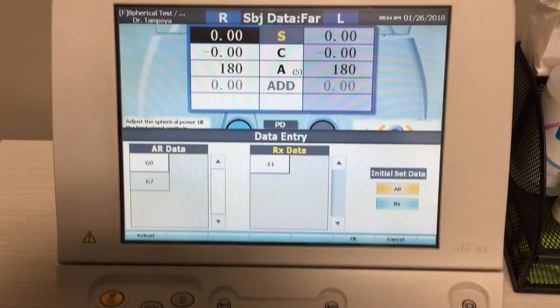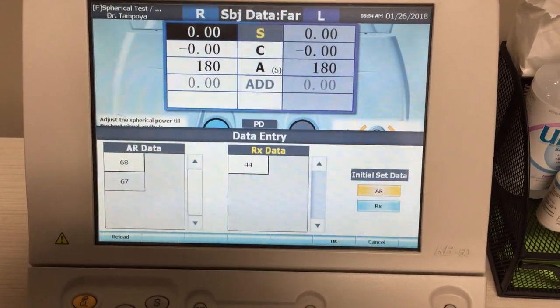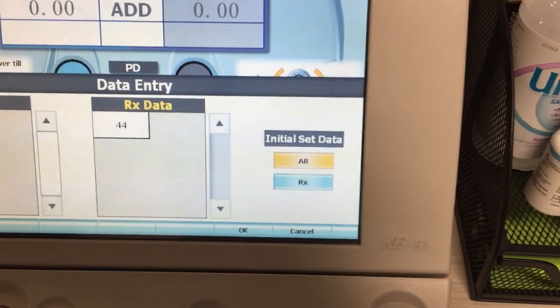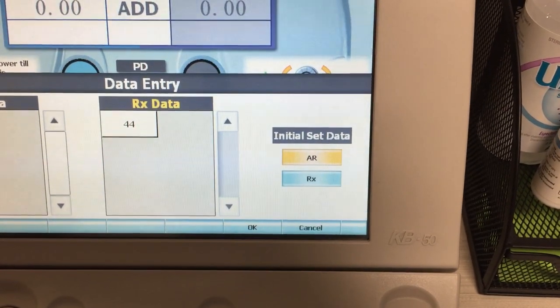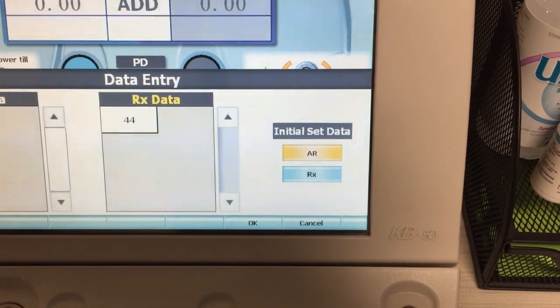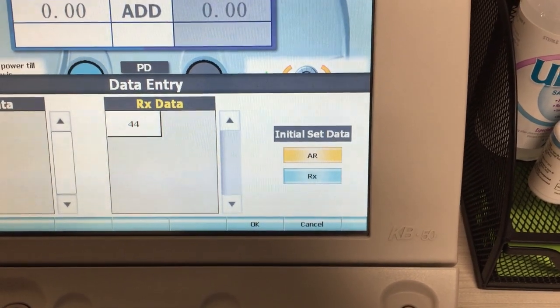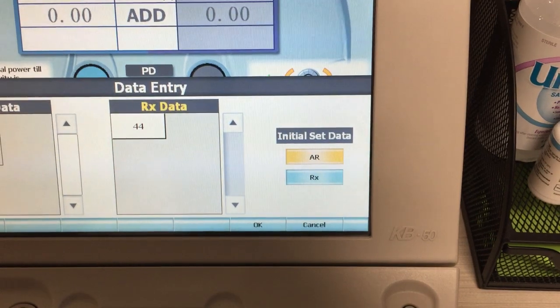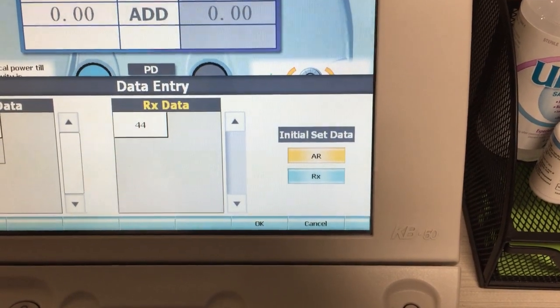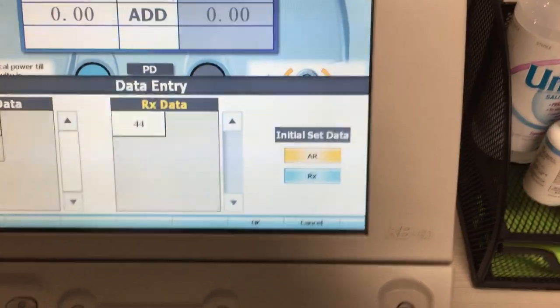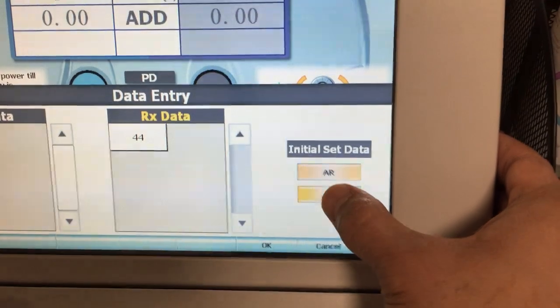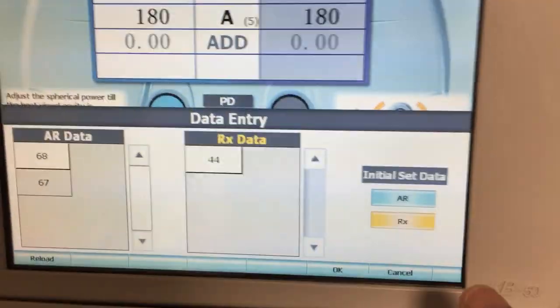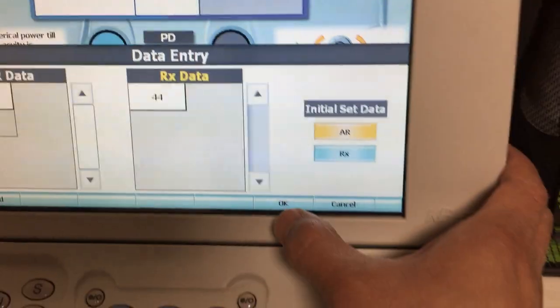For lensometry that corresponds to 1044, which is 44 here on the screen — it only inputs the last two digits. The initial data set on the far right is what the computer will input as your starting data set that you can change and begin the refraction with. You can start with the AR data or the Rx data — you can choose. I always like to start with the AR data, so I'm going to tap that and press OK.